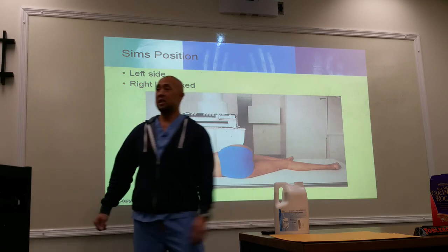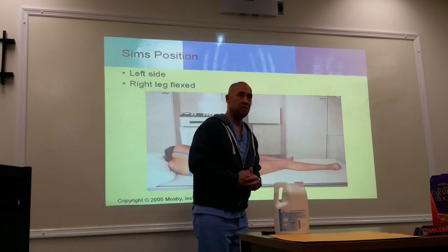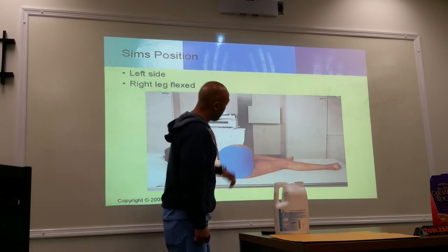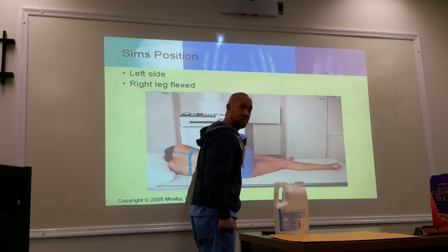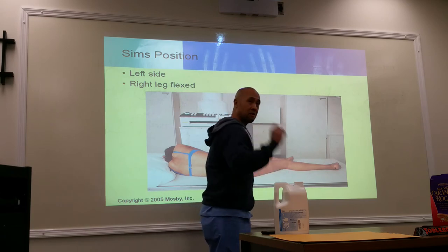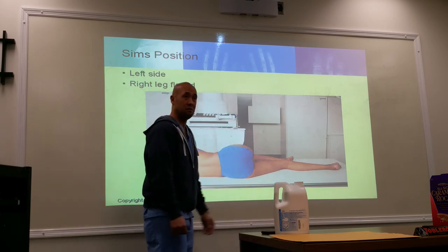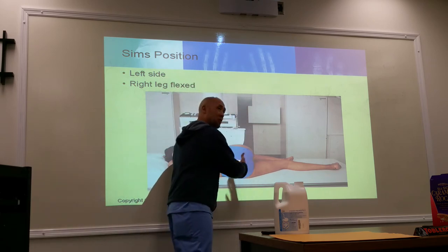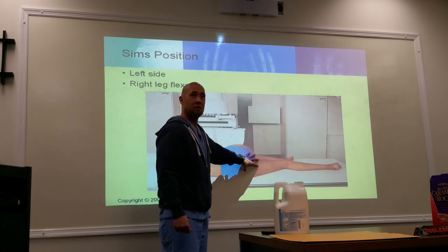The other thing I want you to keep in mind is that when putting the tip in, you have to put your face down there to look at where you're inserting the tip. If you have a female patient, especially an older patient, remember there are two holes here. Don't hit the wrong hole.